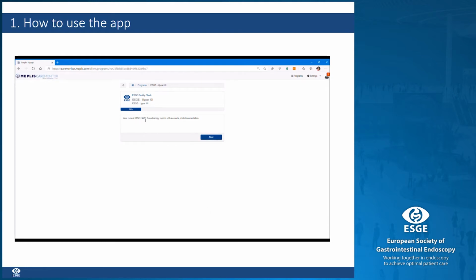Again, our current standard for photo documentation. So we measured the inspection time for Barrett's. Yes, we did. So it was a C4 M5 and we took 5 minutes just for inspection of the Barrett's. So again, our performance measure, not so good in this one.